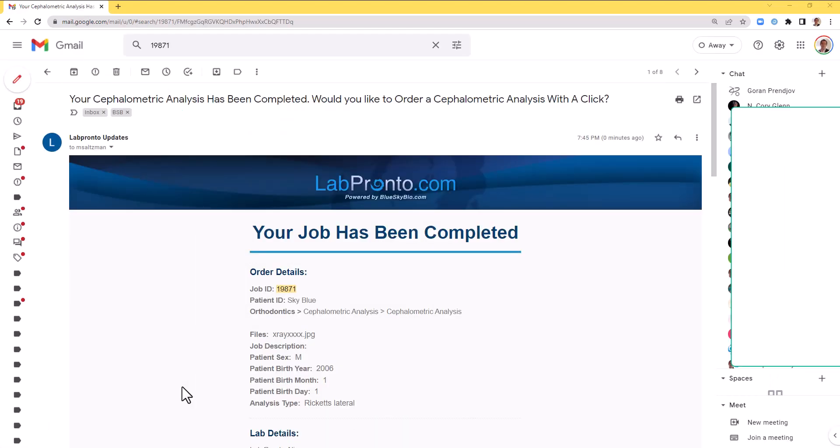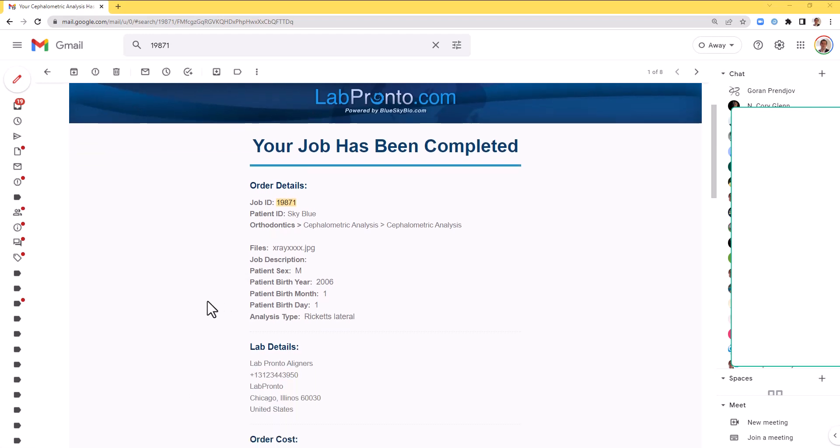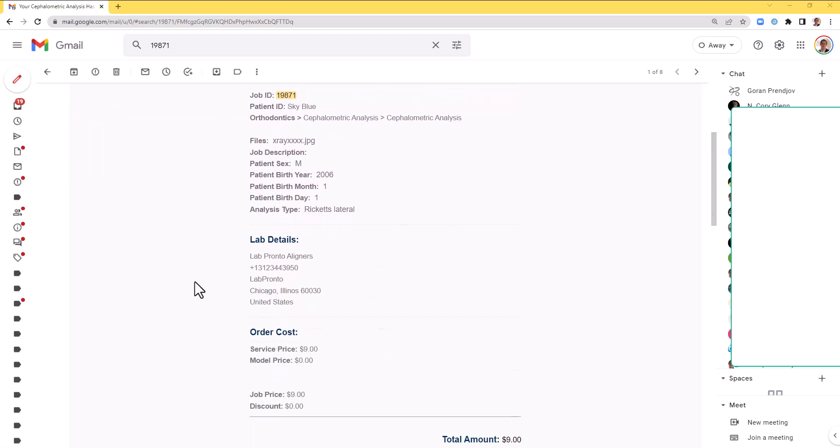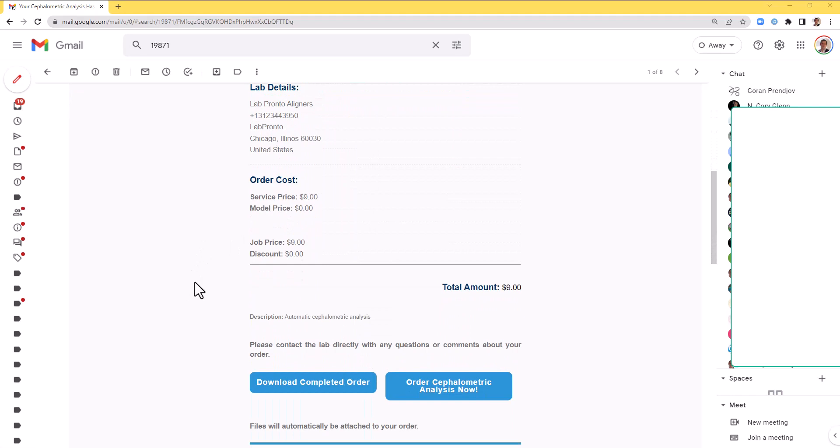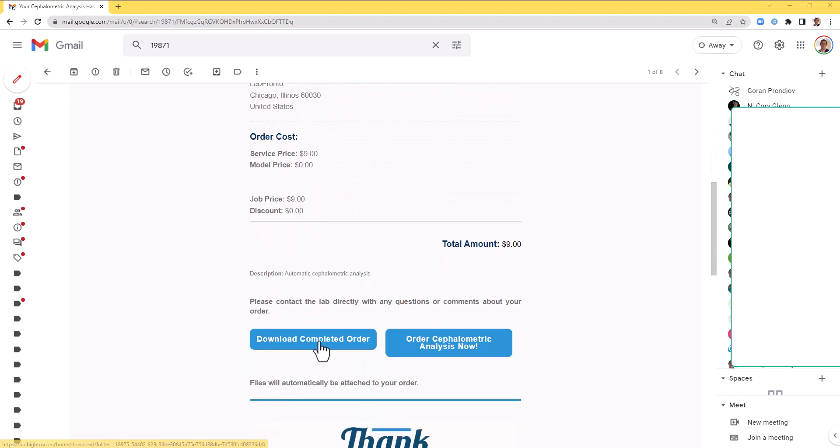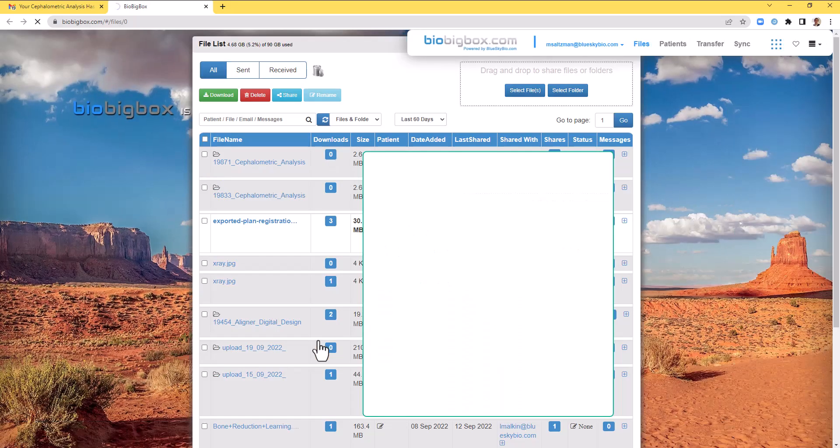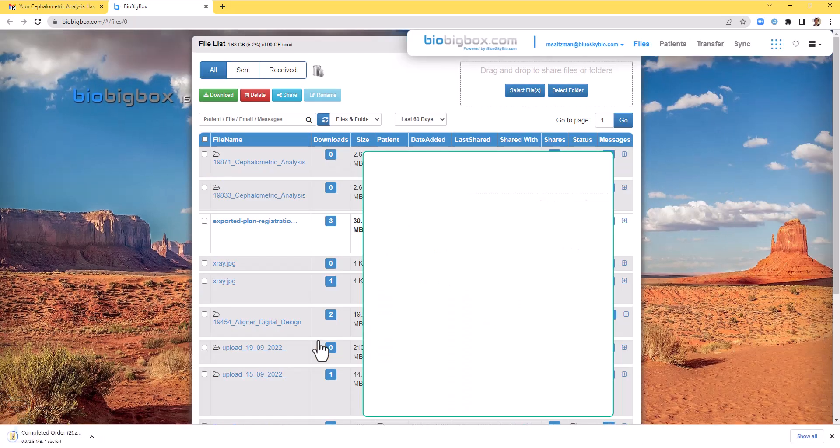Around two minutes later, I've received an email. Your reference information is connected to the order, and then I have a button to download completed orders. The order will be downloaded to your default downloads folder on your computer, and it will also appear in your BioBigBox account automatically.